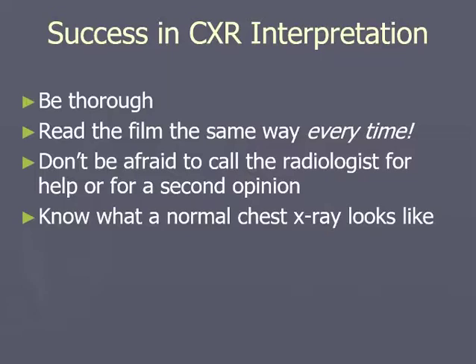And last but not least, be very familiar with what a normal chest x-ray looks like. Once you know what a normal one looks like, the abnormalities will pop out very quickly and it'll be very evident.